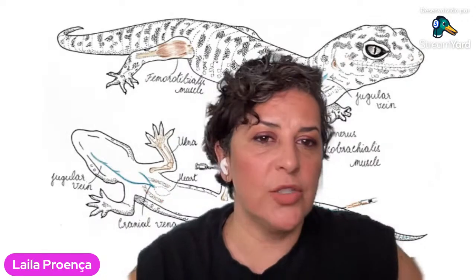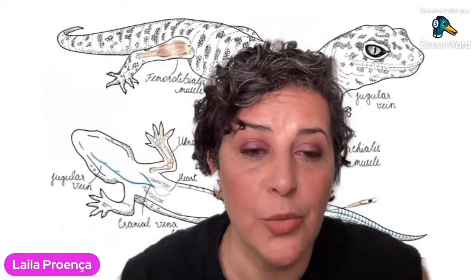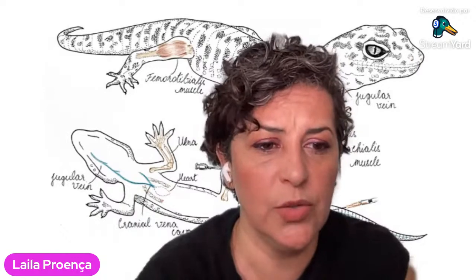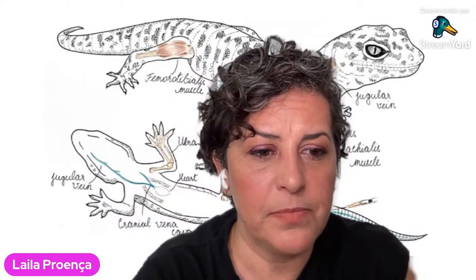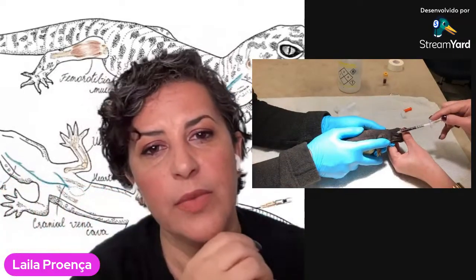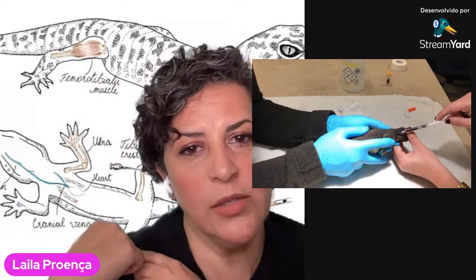Okay, and for the jugular, actually, you don't need to sedate them. The jugular in iguanas is humongous, okay? There's a small learning curve. So what you want to do for the jugular vein, and I'll show you a video right now, is hold the animal in lateral position. They don't need to be sedated. Then you lower the head to expose the neck, and you're going to aim kind of for the shoulder.